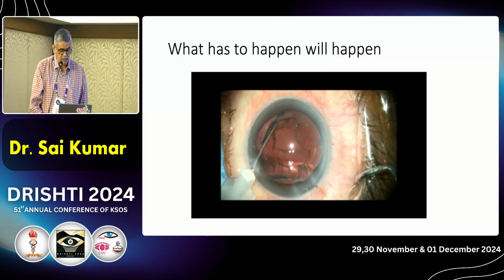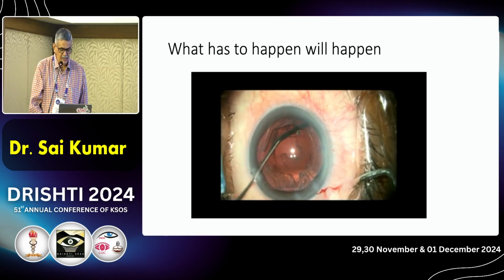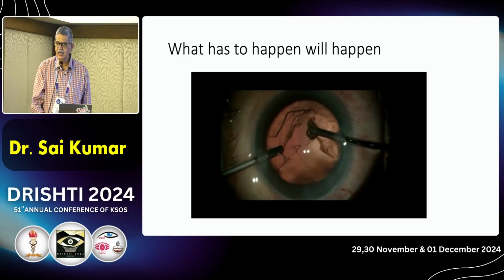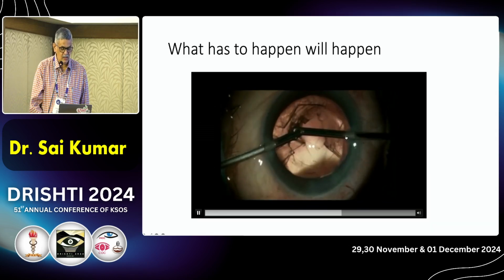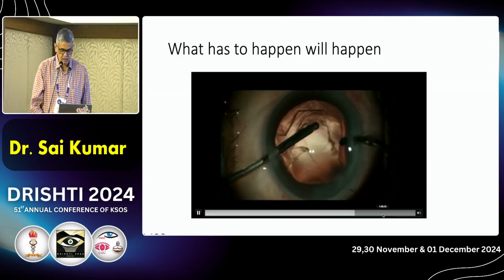It was not when it went in. When I took it out, I was wondering, oh my God, this must have gone and hit the retina somewhere. That much deep it went inside, but luckily it stopped short of the retina. There was a significant amount of vitreous there, so I did an anterior vitrectomy.